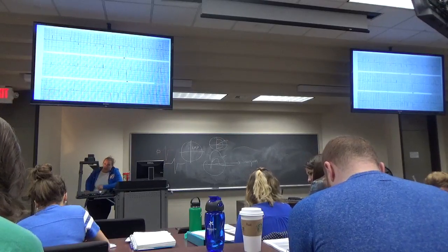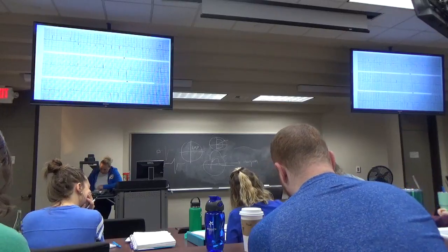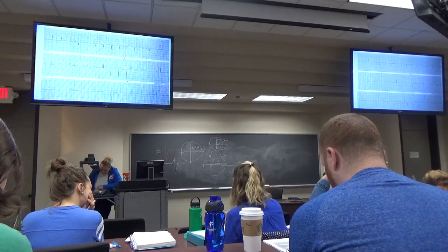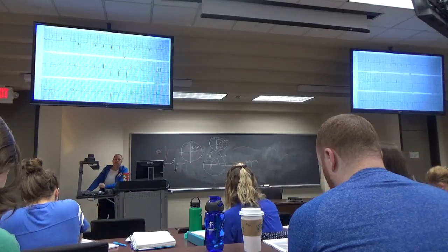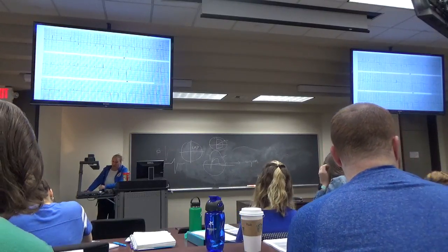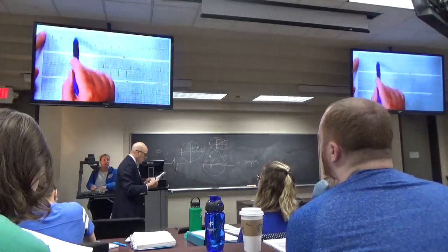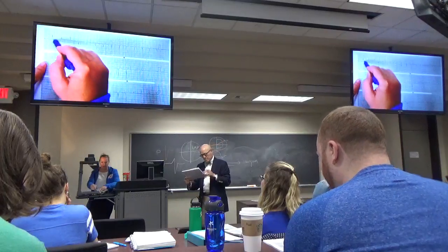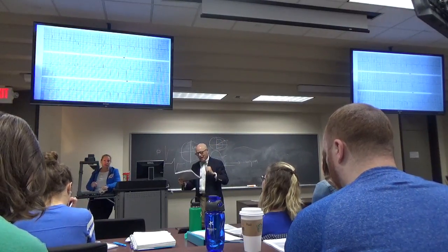So you look at something like that, then look at the rest of the EKG and see if you see the same thing. If you don't, they probably hiccuped or moved, so it's probably an artifact of some sort. If it's there in all the leads, then you have to figure out what it is. But if it's only in one or two leads, it's an artifact. Especially if you look at the leads lined up in a row, and there are squiggles in that same small spot, then it's movement. It's artifact.